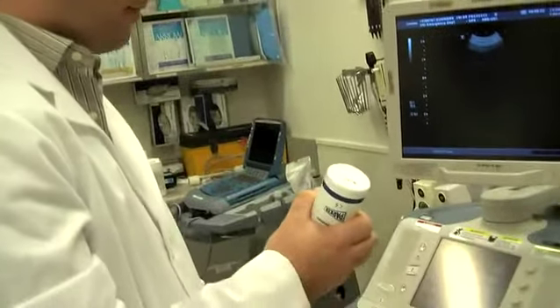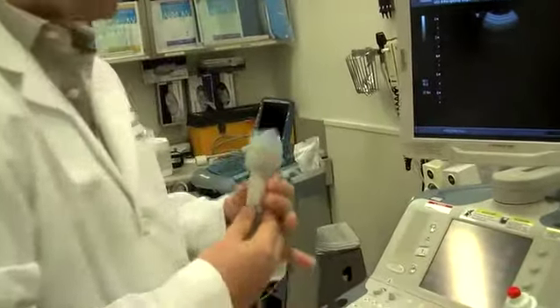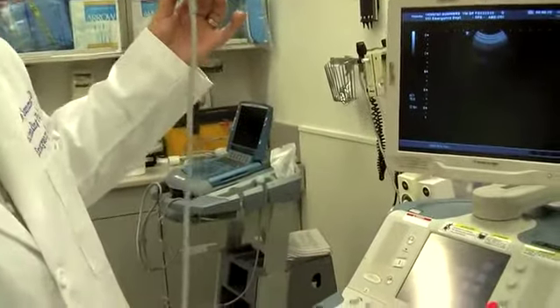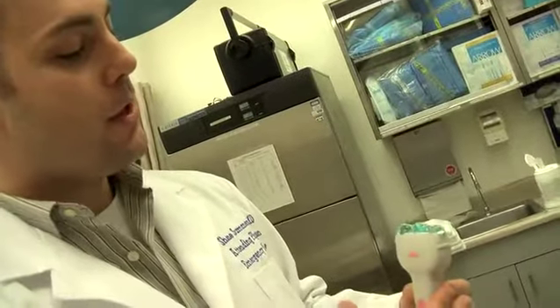Now for this scan you want to use a higher frequency probe because the pleural line is actually very superficial, just underneath the ribs, and we want to use the optimal or the highest frequency possible to image the structure of interest. And since it's so superficial, we can get away with using a higher frequency probe.